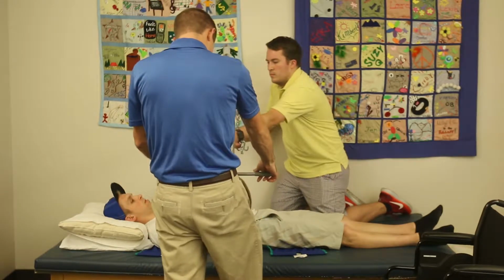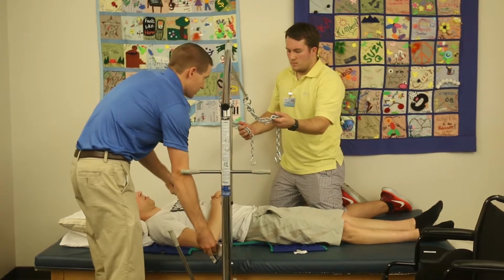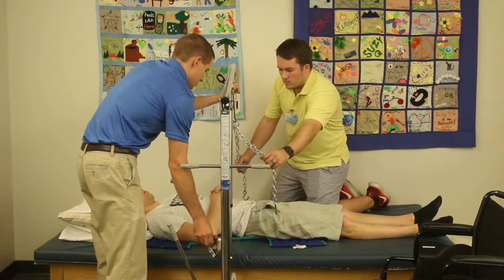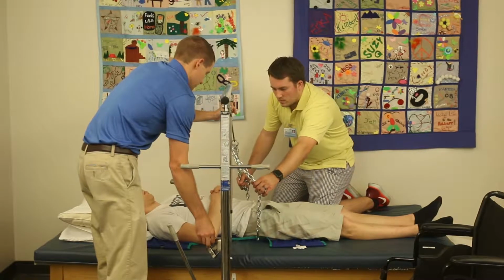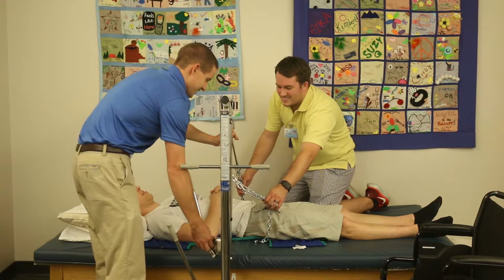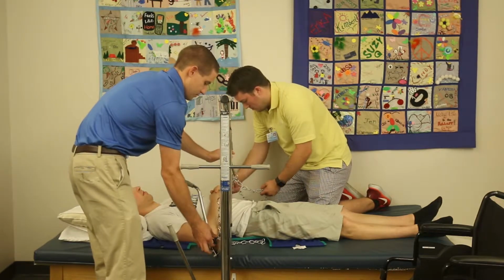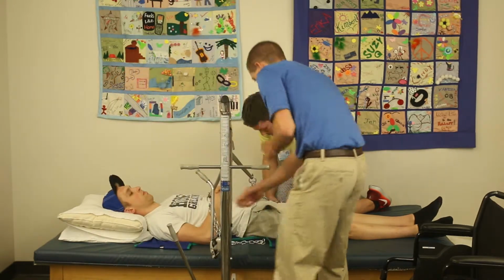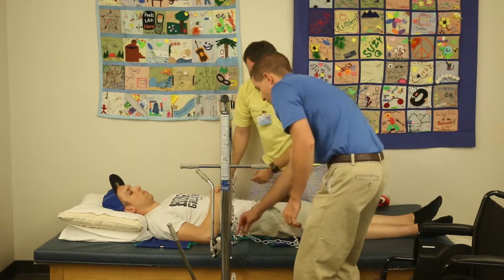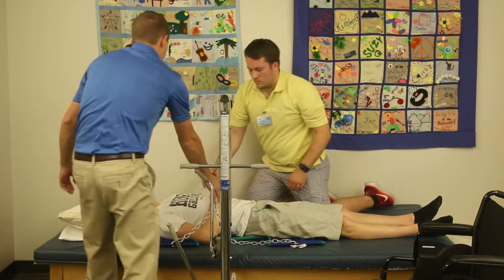So before we do that, let me lock the wheels. Okay. Now hold those there for me out of the way and let me lower it down just a little bit. Squeaky little thing. Okay, some WD-40. Yeah. I'll talk to the hospital administrator about that. Alright. Okay. You got the long one. You make sure that was out of the way. Short one. Same thing, out and away. Okay. Now we're good there.